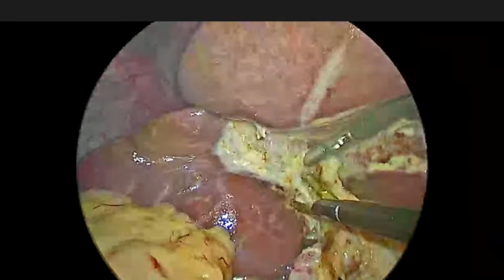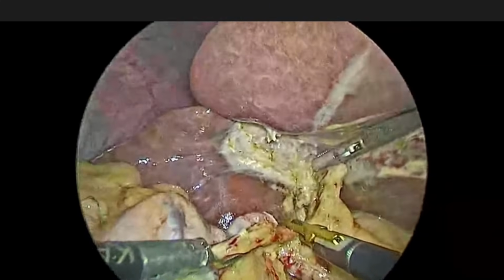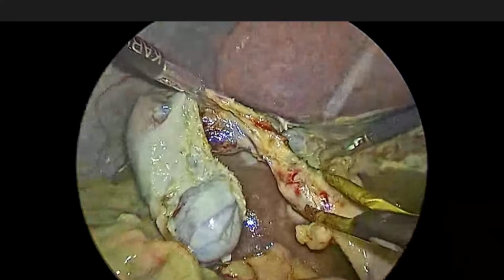It was because we are not sure about the anatomy at the Calot triangle, so did not want to do any injury to the common hepatic duct or common bile duct.